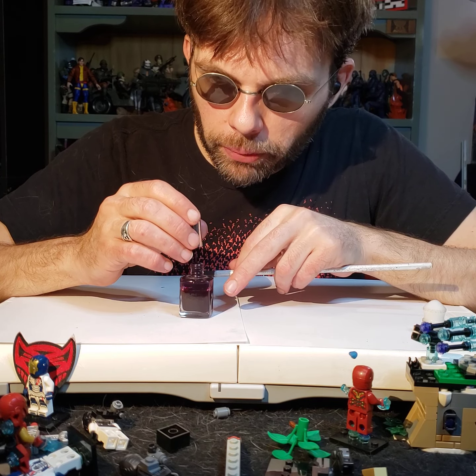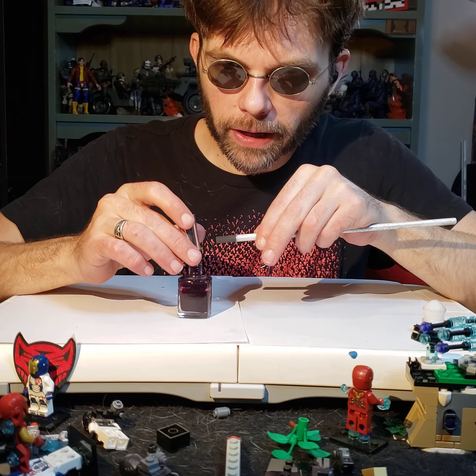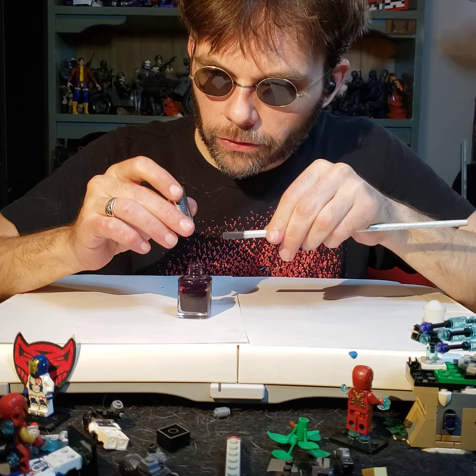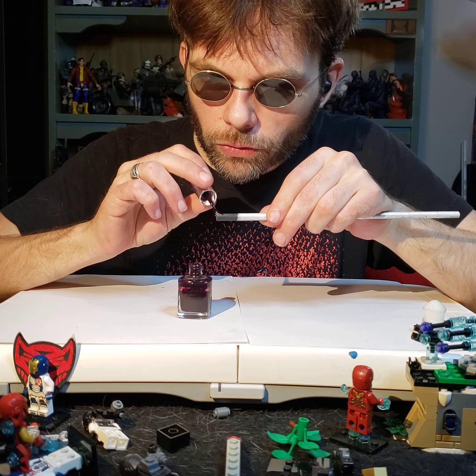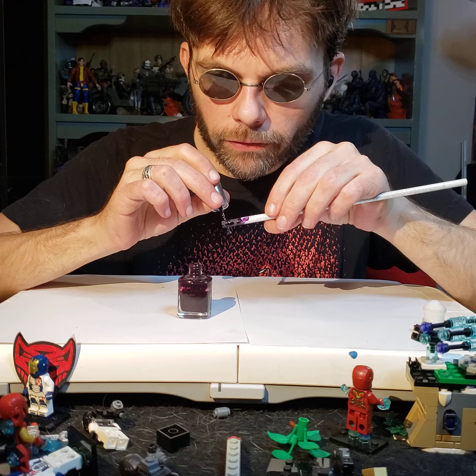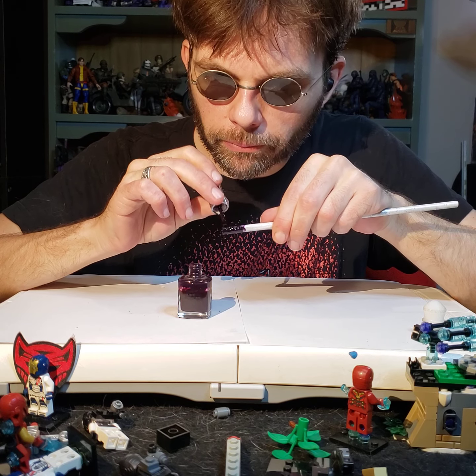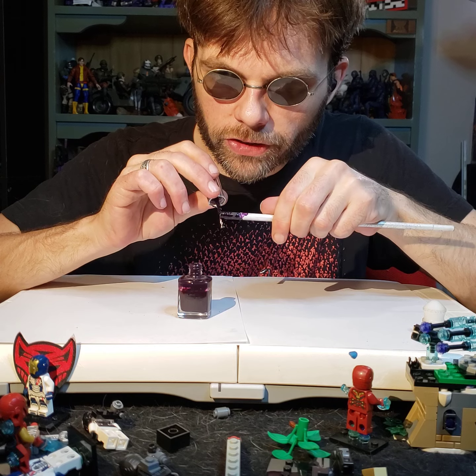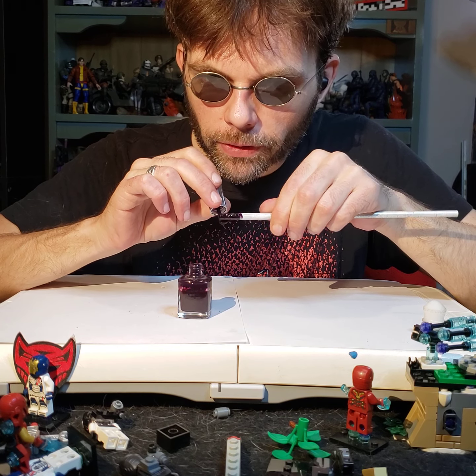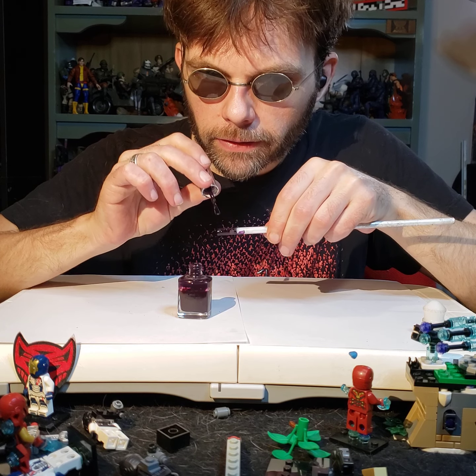So we're going to pull out our red. Ooh, wow, that is a vicious smell. Oh, man, I forgot about that smell. Okay, good God. All right. Let's go ahead and start painting. You don't have to be perfect with your paint job for the cane. You just got to make sure you put on just a millimeter of paint. You're just trying to put on enough paint so that your cane can actually stay together.